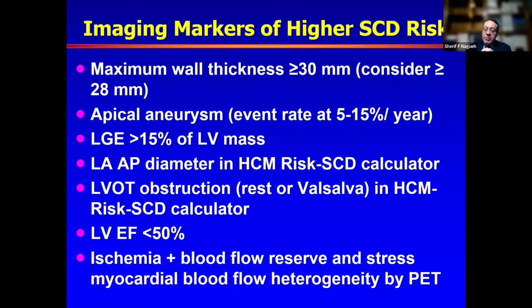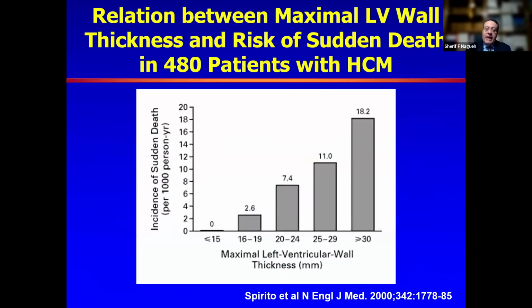This conclusion is based on small studies with SPECT in the older literature, and as such, they do not factor in day-to-day practice, but be aware that these patients have ischemia, and it can be a cause of problems for them, be it angina, dyspnea, and potentially arrhythmias.